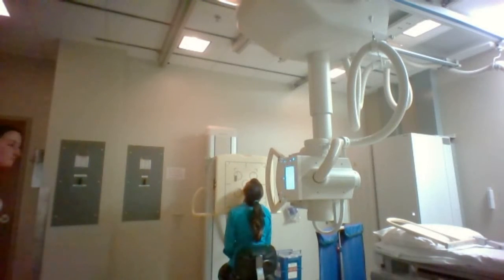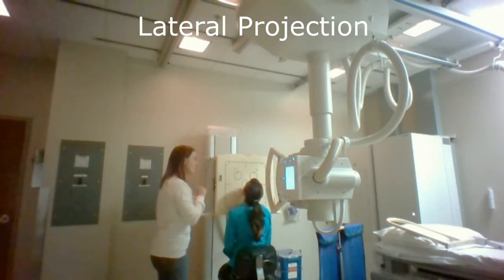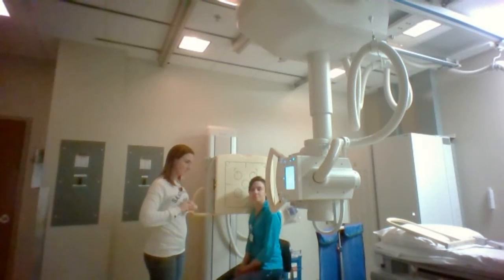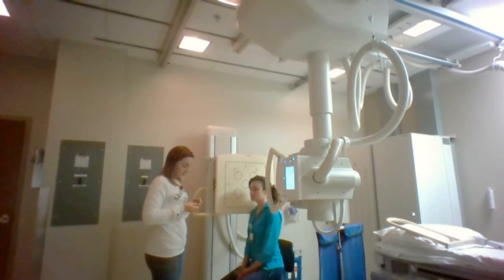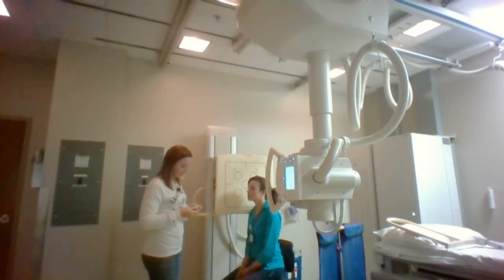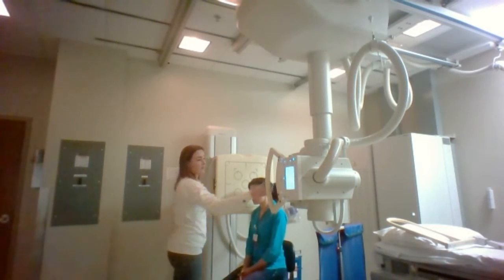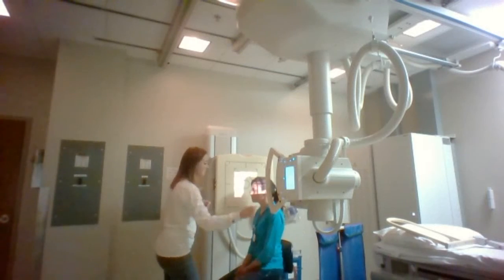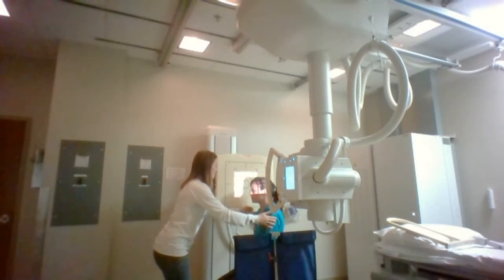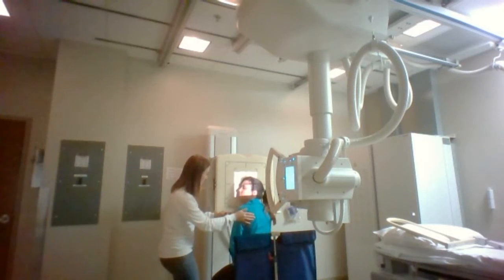Expose. Okay. So now I'm going to be moving on to do my lateral projection. Sky, I'm going to have you turn and face me. This is going to be placing her right side against the board. And in an effort to reduce distance, we're going to have Sky in a RAO, and her head turned towards me. So Sky, I'm going to have you turn and then look at me, and then we'll scoot you in towards the board so your cheek's on it.